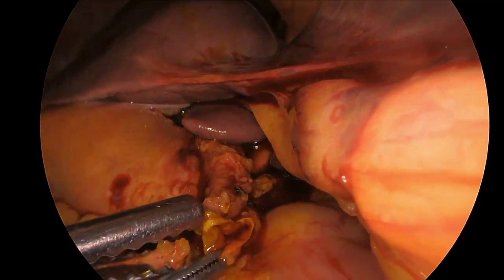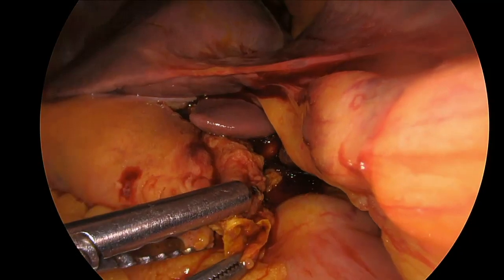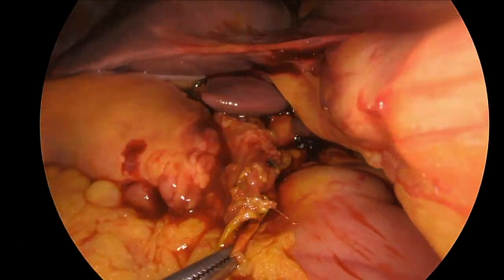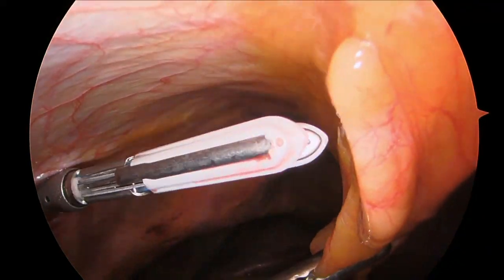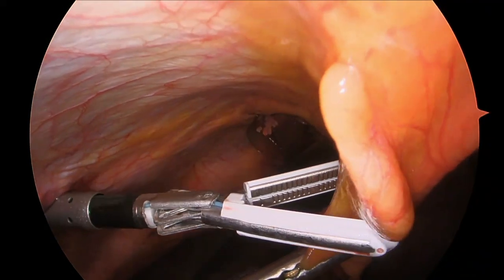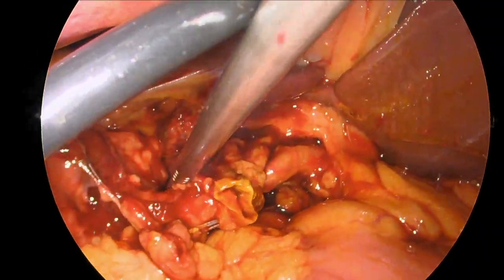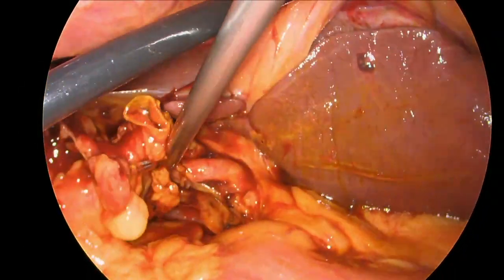Upon exploration, we could see that the gallbladder was still attached to the bile duct. A clip across the transected proximal biliary tree was removed. In order to create more room to visualize the operative field, the falciform ligament and ligamentum teres were detached, which allowed us to retract and see the operative field somewhat better.